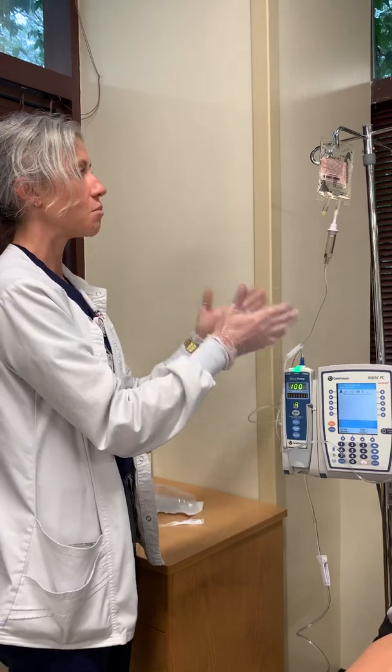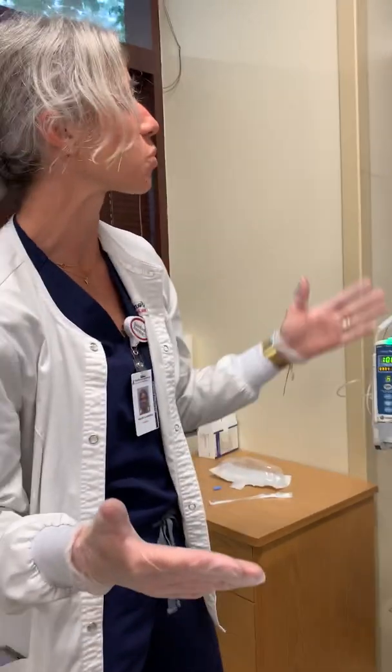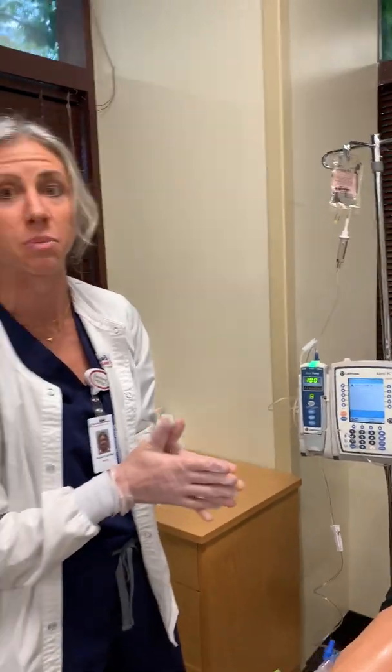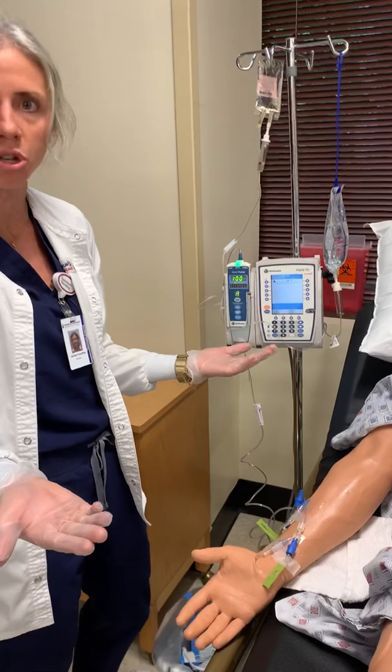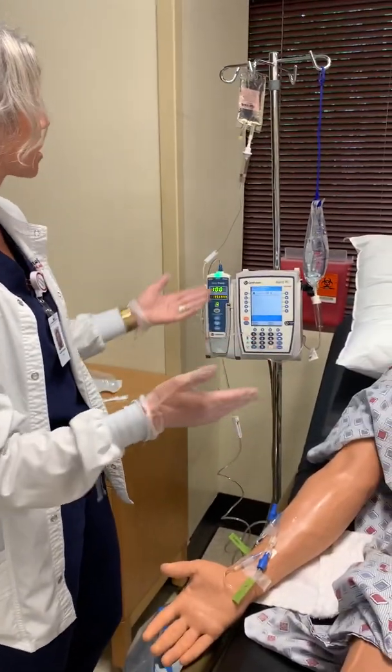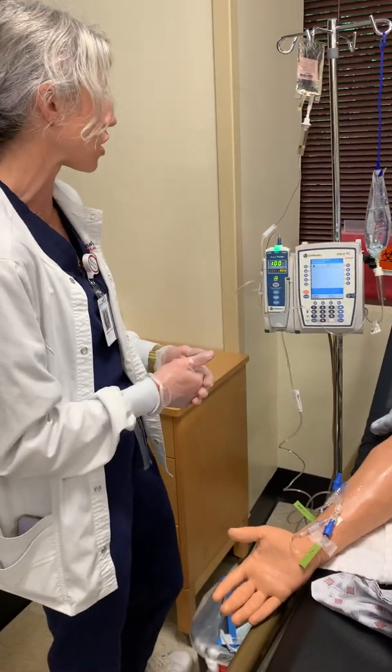Make sure that it's running okay, because what are we always worried about with antibiotics? Possible allergic reaction, right? We're always concerned about that. So stay with your patient for a little bit. Talk to them, make sure everything looks good, okay? We'll look at the IV site, make sure everything's still running good, okay?